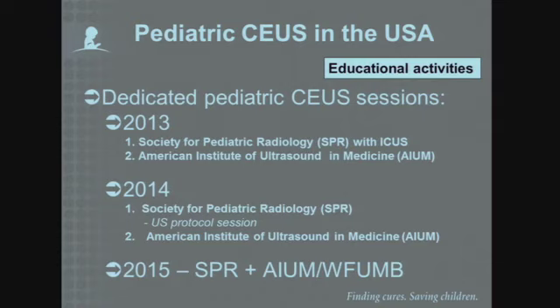So there are also a growing number of educational activities that are available to interested parties. The first dedicated pediatric contrast ultrasound sessions were given at the ICUS meeting in 2013, and also in 2013 at the American Institute of Ultrasound in Medicine annual meeting.